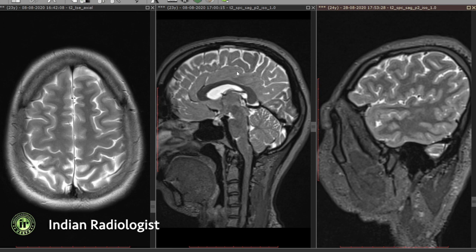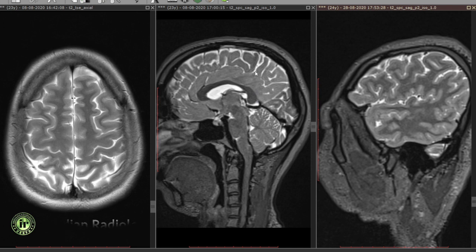On midline sagittal images, we first identify the cingulate sulcus which runs superior to the cingulate gyrus. At its posterior limit, almost vertically above the splenium of the corpus callosum, it divides. The marginal sulcus ascends to the vertex. The surface notch immediately anterior to it in the cortex is the central sulcus.